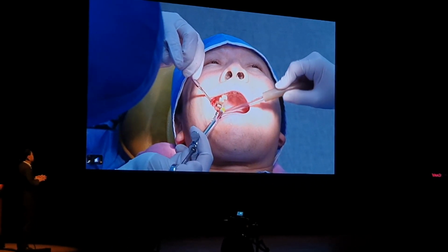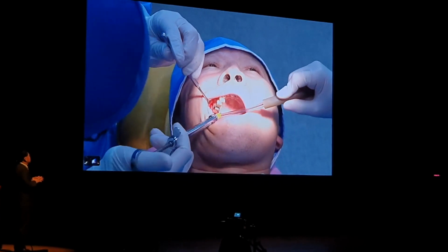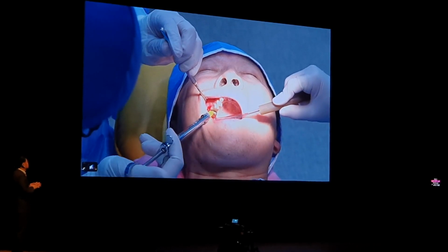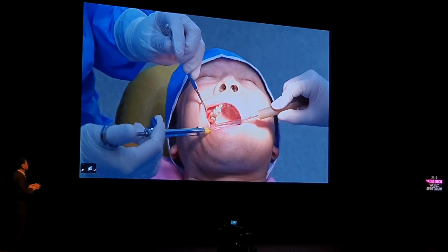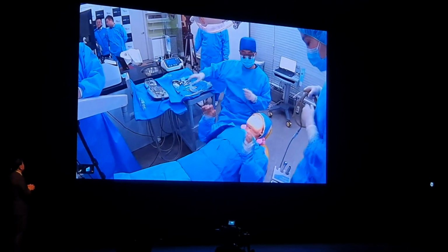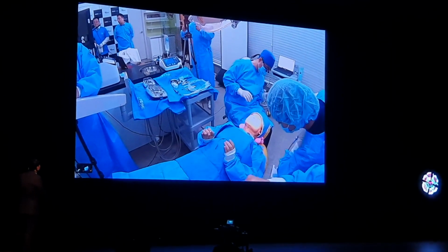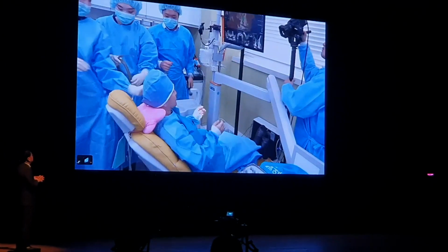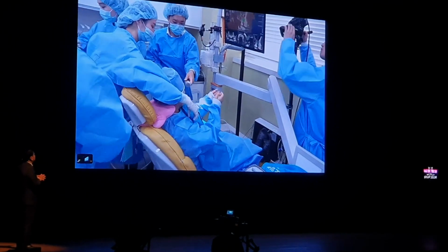Everything all right? Can you ask Dr. Ho if he feels pain? Yes, I just asked him, and he says he's okay. So please prepare a mirror here. For anesthesia, did you use 1 ampoule? I used 2 ampoules. So please give him the mic.